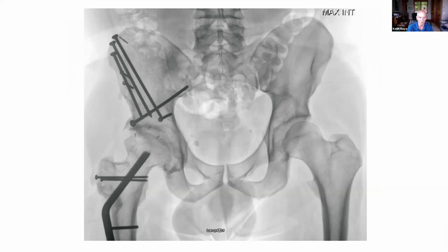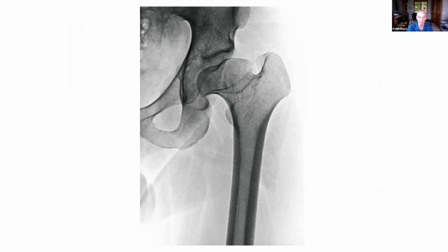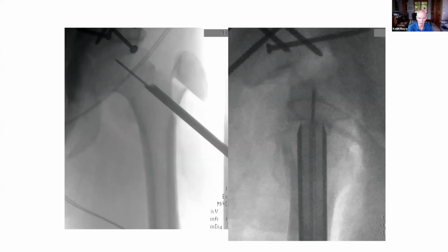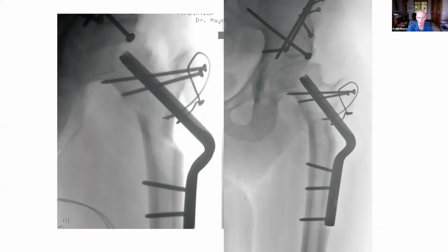And that's probably as much as I'd be willing to do. This was a 20-year-old when we started. And then a more extreme example is this, which is a more severe coxa breva associated with Perthes disease. And so we've been through the trochanteric osteotomy, the dislocation ultimately, and then the seating chisel insertion, and then a long oblique osteotomy. And then in this situation, we're gaining a leg length as well as an offset, which effectively gives him a much longer femoral neck.